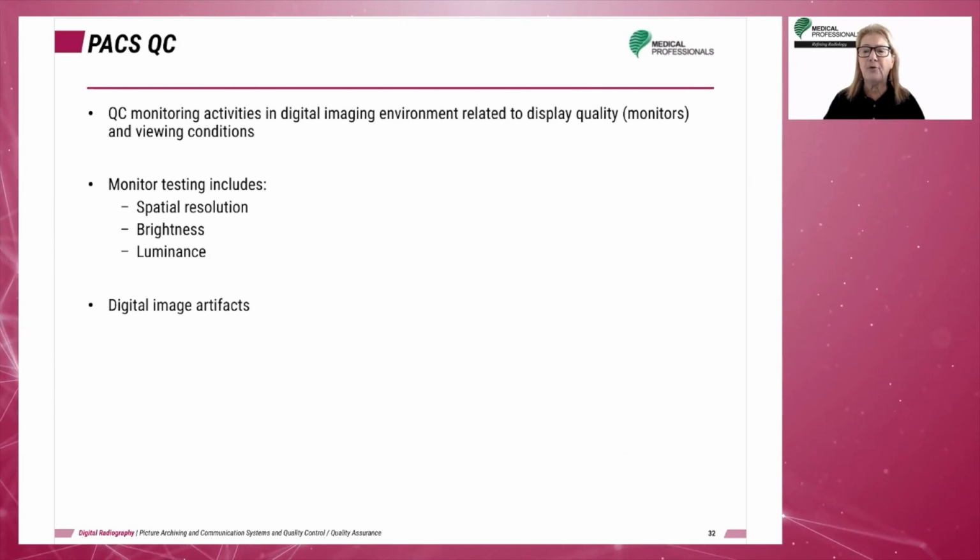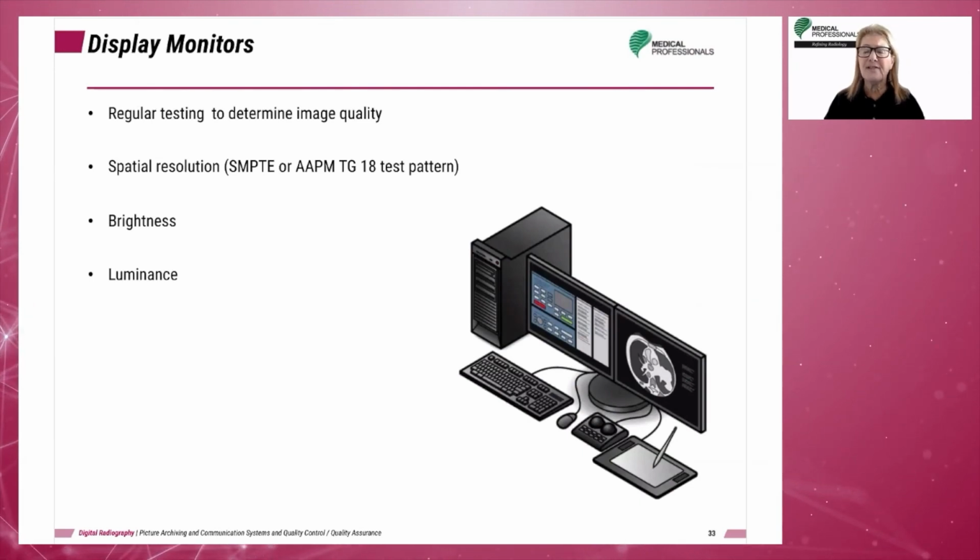In addition to the quality parameters previously discussed, digital imaging QC activities are also related to the PACS, workstation, and reading monitors, and to image artifacts. As previously stated, both the ACR and the AAPM recommend regular QC testing. However, they differ in their timelines. The ACR recommends testing at least monthly, while the AAPM recommends daily and monthly procedures that may be carried out by the radiographer and annual tests that need to be performed by the medical physicist.